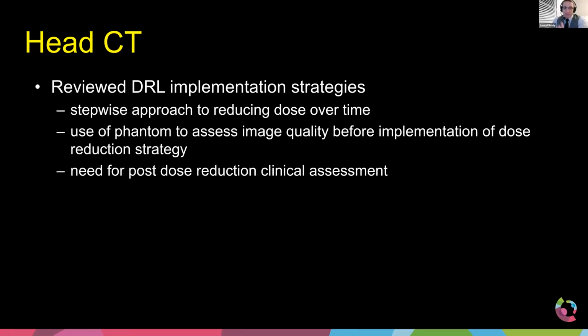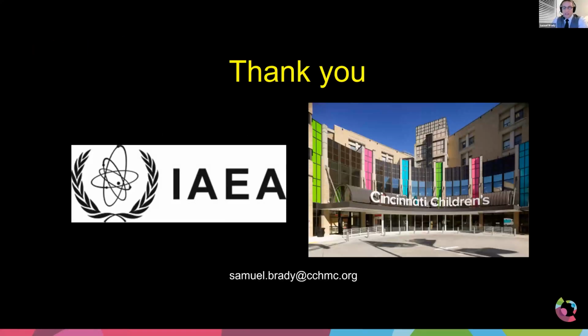But in both cases, just worth pointing out, there was always a clinical assessment, and I think that's really important. That's part of that whole optimization team. You need to have a radiologist there with you, so that they are the ones that have the eyes for what they need to see in the clinic. And we, the medical physicists, the technologists, even the IT PACS people, we're here to help them do their job. And so everything we've talked about, image quality optimization, dose optimization, all of that doesn't mean a thing if the radiologist looks at the image and they don't have diagnostic confidence. So that's the end of my second talk, and I turn the time back to you, Tanya.